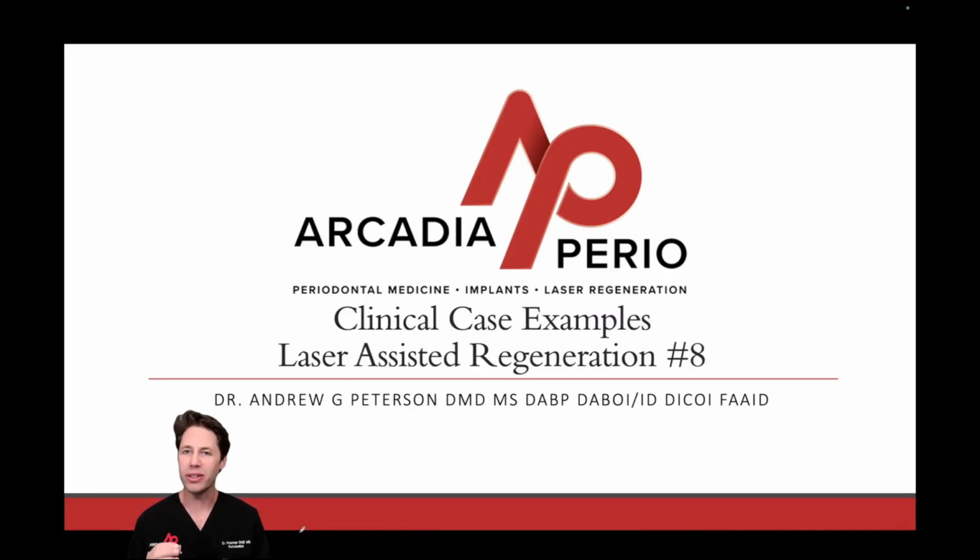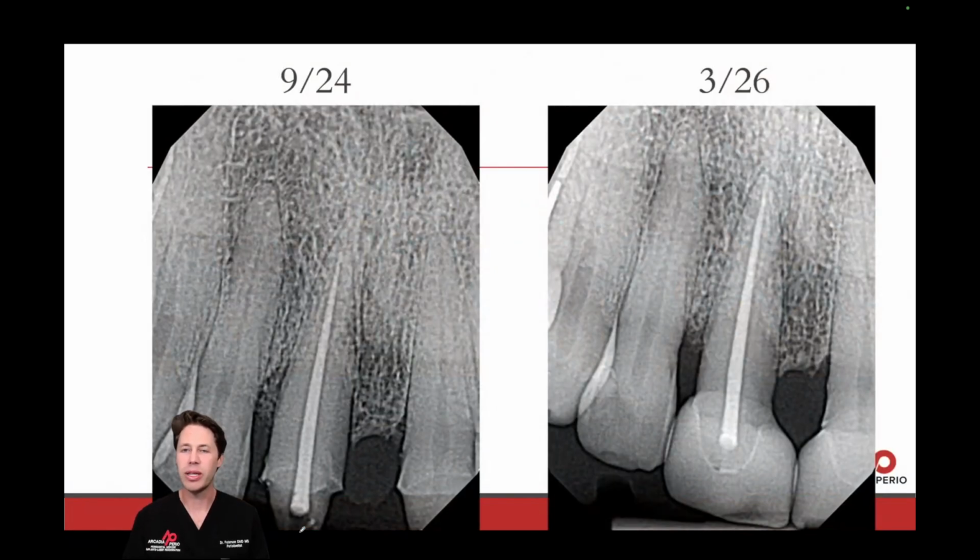Let's show you a clinical case and highlight those key clinical concepts that'll show you why this treatment modality should be your treatment of choice in the anterior aesthetic zone. Let's dive in. This case was referred to me by Dr. Nathan Koo, a restorative dentist in Duarte, California. Unsure of the periodontal prognosis, he referred this case to me prior to fabrication of restorations on 8 and 9.